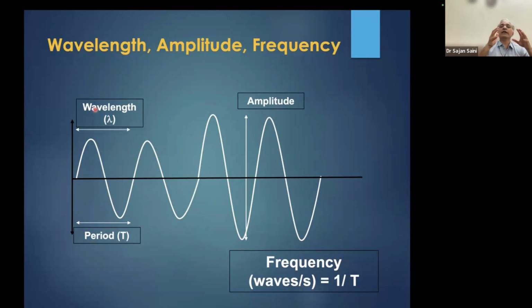So if we want to interrogate deeper structures, we want to use a transducer which throws ultrasound beams with a greater wavelength. But the downside of this deeper penetration is that they have lesser frequency. And once they have lesser frequency, these structures are not that well represented on the screen, or in other words, they have a lesser resolution. We'll discuss the resolution shortly.